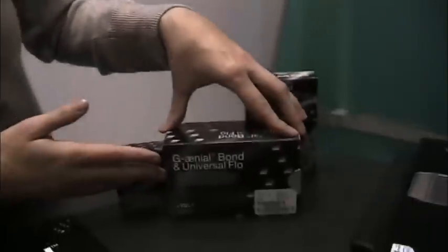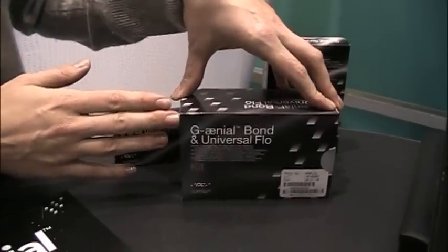Hi, I'm from GC America. We're launching two new products here at the Yankee Show. We're sorry you couldn't make it, but we will also be featuring this at the Chicago Midwinter Show. The two new products we're launching are in the restorative category, and we're showcasing them here in the Genial Bond and Universal Flow Kit.